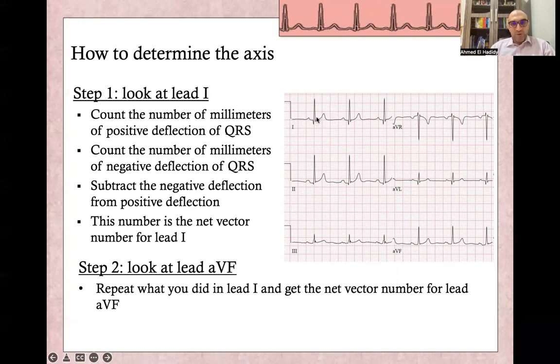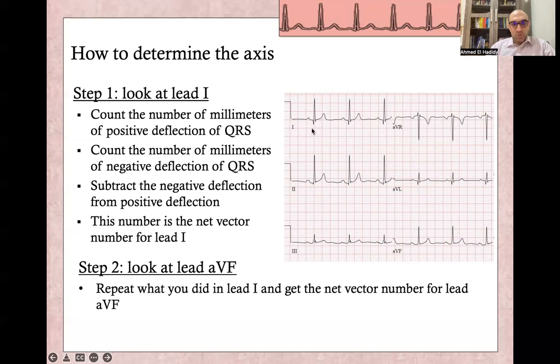First we will count the positive small squares for the R wave in lead I. So we count 12 small squares. Then we count the small squares for the negative S or Q waves, which will be two. So 12 minus two — the net vector for lead I will be 10 small squares.